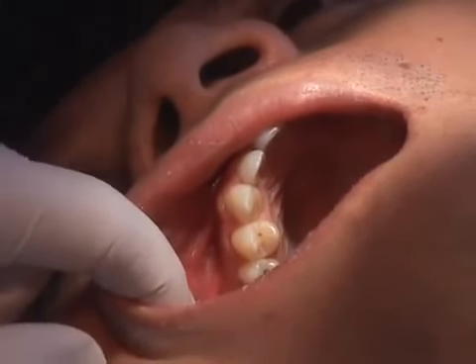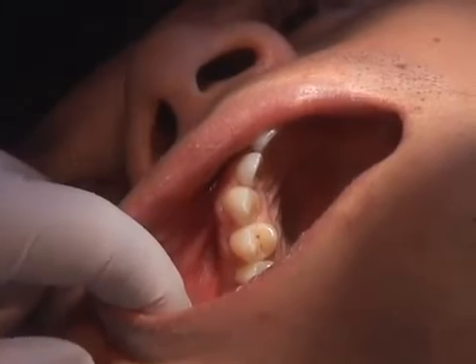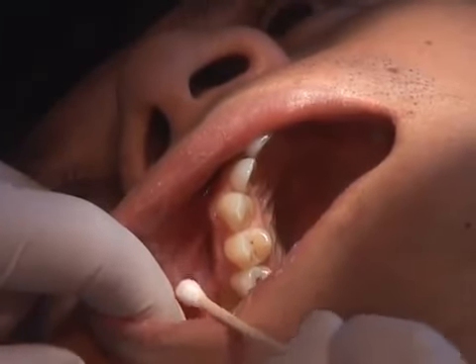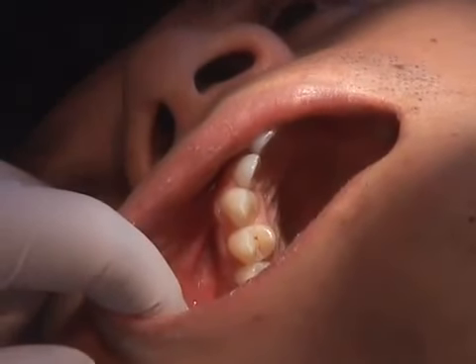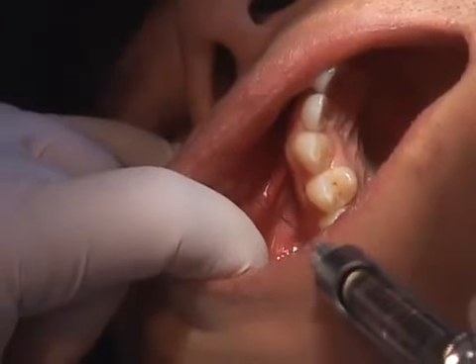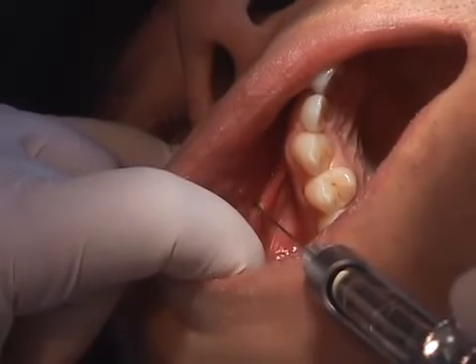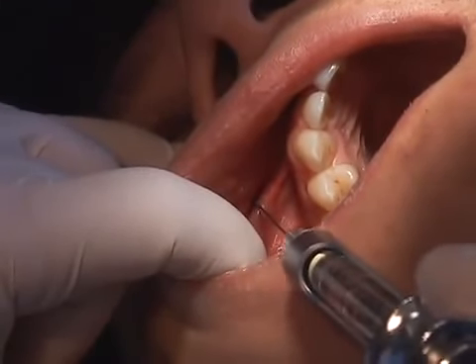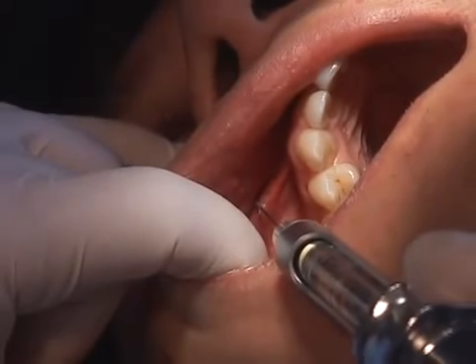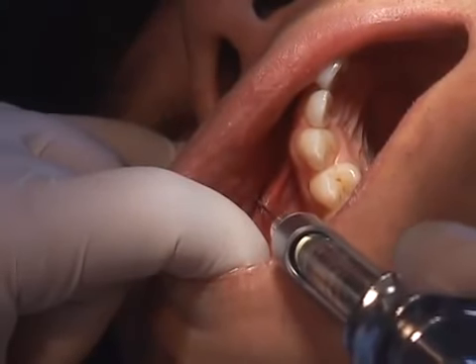Prepare the syringe with a 25 gauge long needle, bevel oriented towards the bone. Apply topical anesthetic to the injection site for 1 minute. Insert the needle until bony contact is achieved. Needle depth depends on individual anatomy, but will be approximately 16 to 25 millimeters.